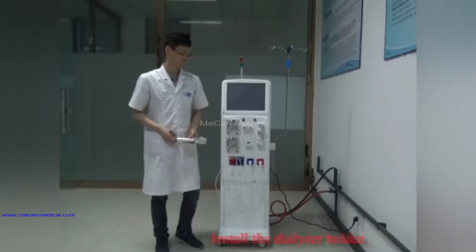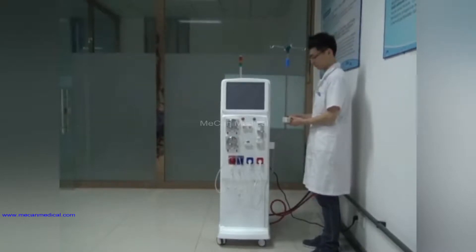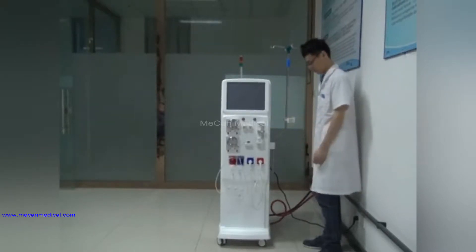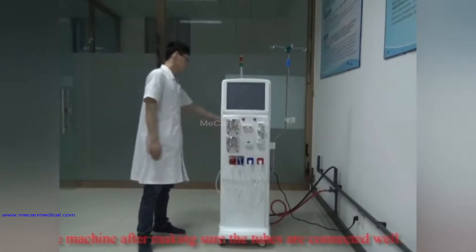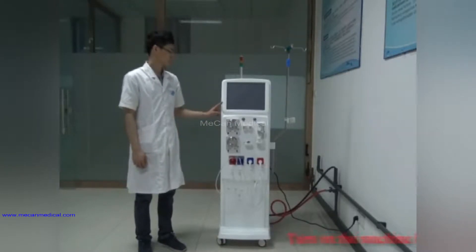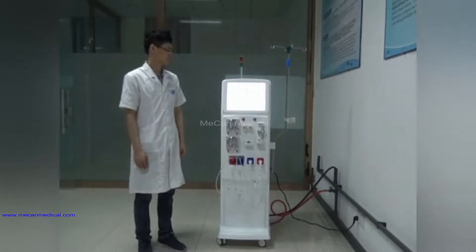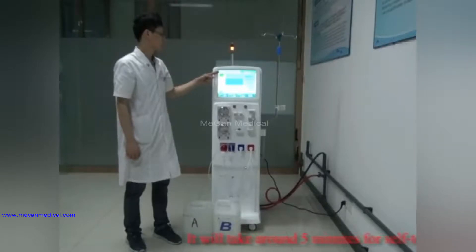Install the dialyzer holder. Turn on the machine after making sure all the tubes are connected well. Turn on the machine by pressing the button. The machine will enter the self-test automatically after turning on. The self-test will take around 5 minutes.